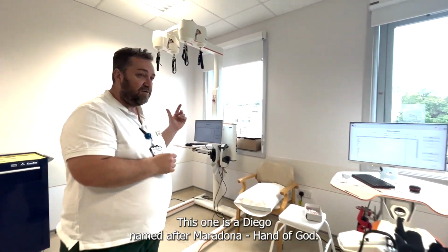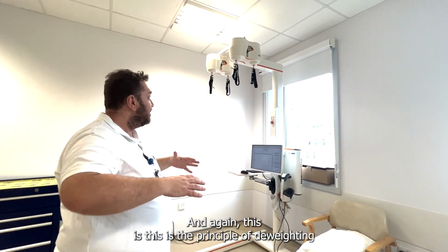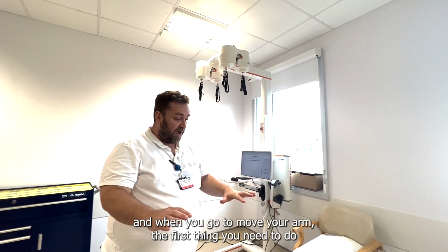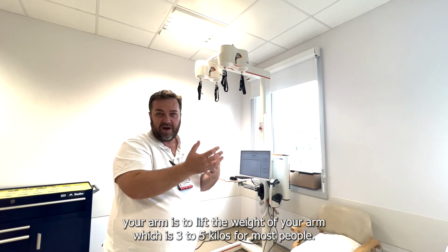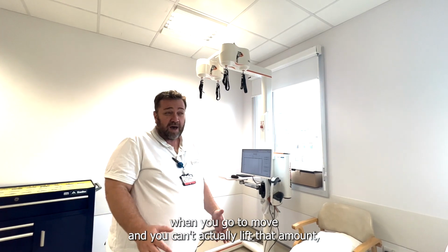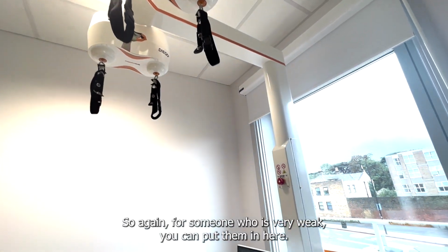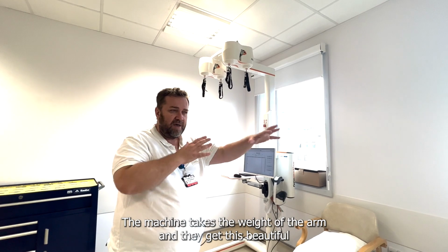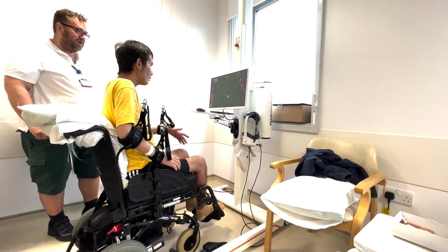This one is a DIEGO, named after Diego Maradona, Hand of God. And again, this uses the principle of de-weighting. When you go to move your arm, the first thing you need to do is to lift the weight of your arm, which is 3 to 5 kilos for most people. So if you're very, very weak and you can't actually lift that amount, then you just don't generate much movement at all. So again, for someone who's very weak, you can put them in here. The machine takes the weight of the arm and they get this beautiful freedom of movement. They're able to suddenly access that movement.